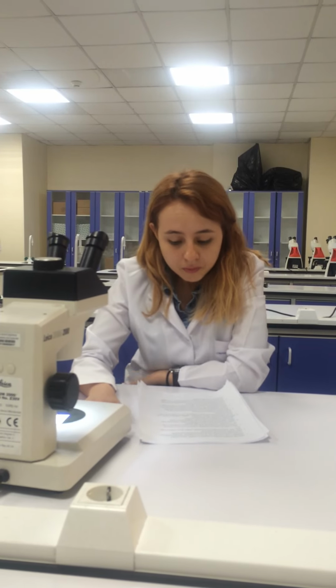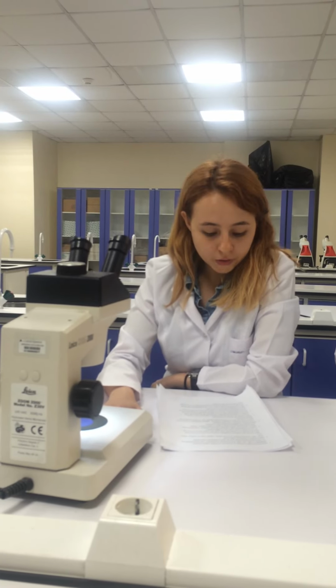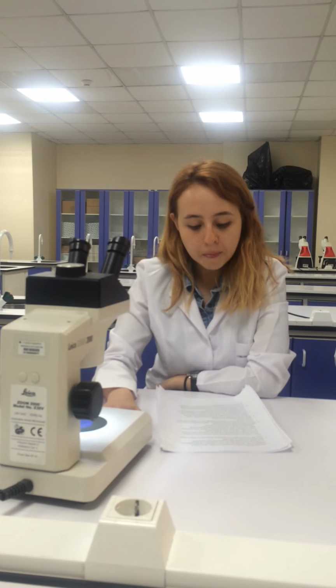Chondrocyte induction medium is prepared with alpha DMEM containing 1% fetal bovine serum, 6 micrograms per ml insulin, 50 micrograms per ml ascorbate 2-phosphate, and 10 nanograms per ml transforming growth factor beta 1. Now the differentiation process of chondrocytes.